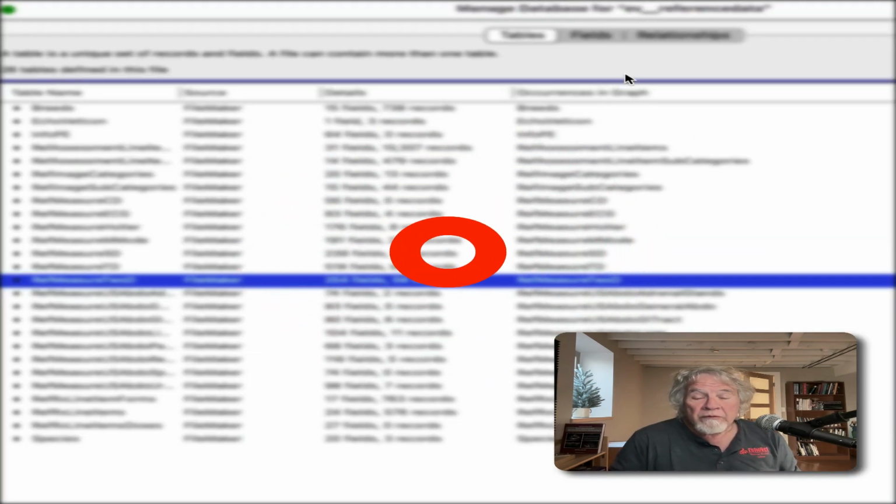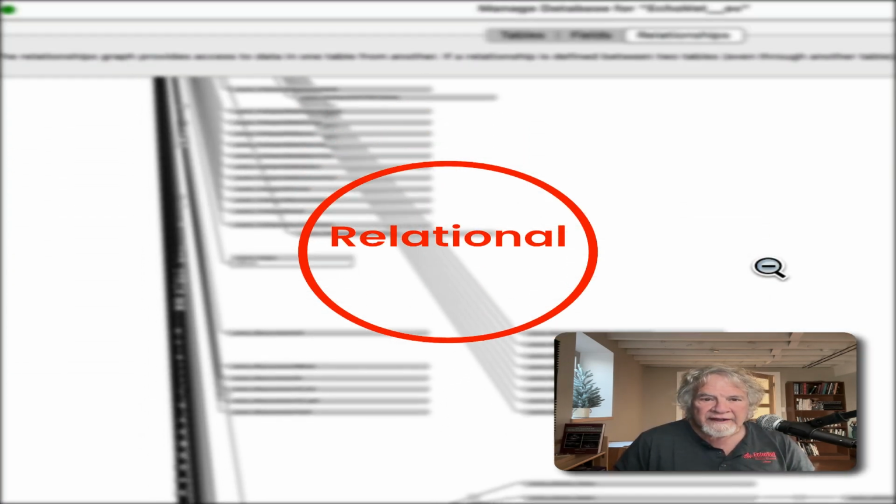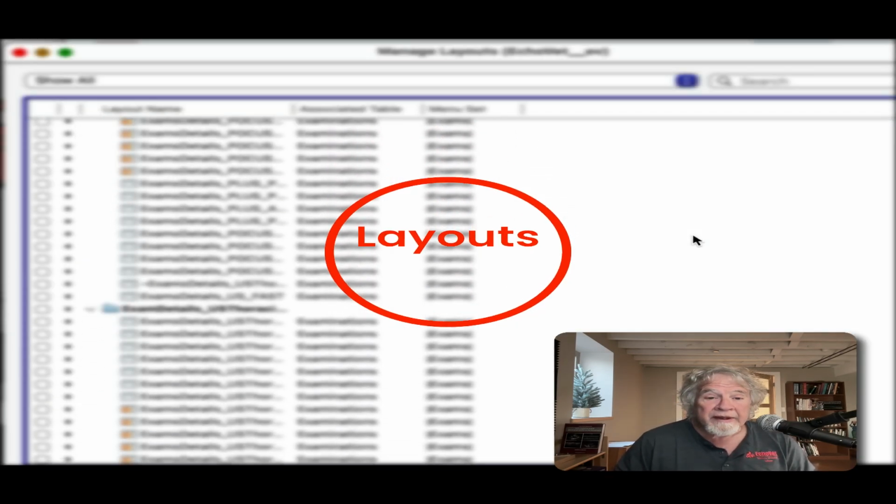And then, there's also reference data. So there's all the references, all this literature that had to be read and analyzed, and then that literature had to be coded. So all that had to be put in, and that's all separated out so that there's both data and then reference data, so that the reference data can be expanded, is really what I had in mind when I did that. It's a relational database. It's complex, and I ended up learning this, and it's been a labor of love to learn how to write a really complex relational database.